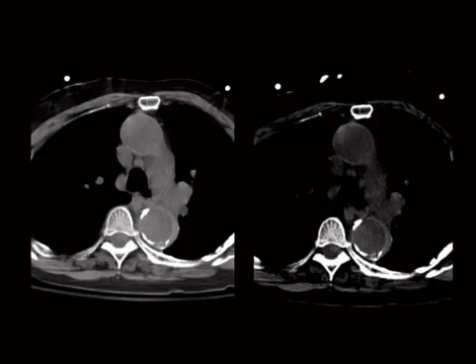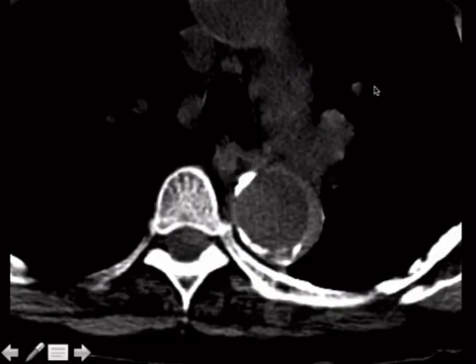So here's the next case. We'll do a zoom up. This is a non-contrasted study, and this image is windowed more like a liver window or a subdural blood window. Take a closer look here. Notice that there's this hyperdense area right here, which is abnormal. If you haven't seen this before, now you have. This is acute intramural hematoma.